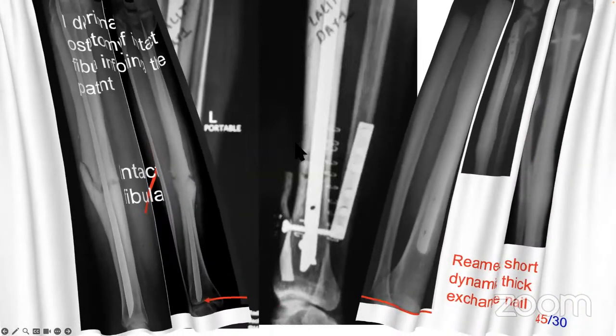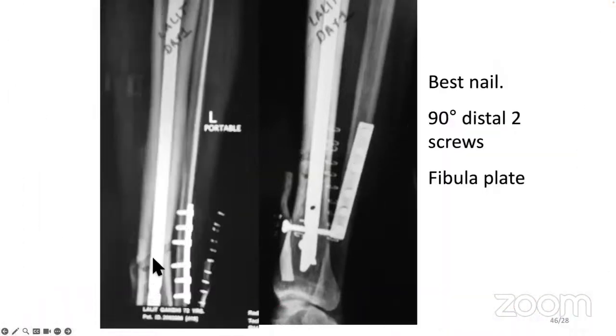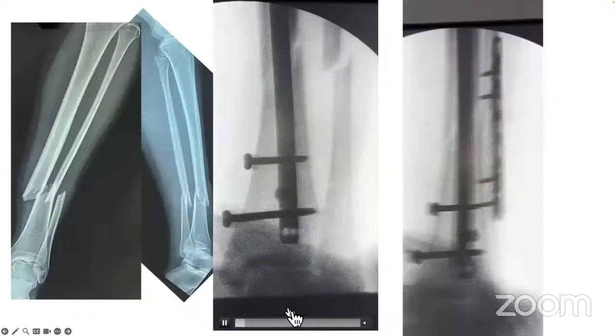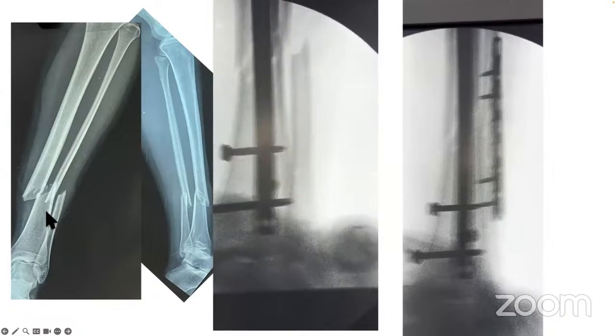Now, this lower one-third fracture, with the fibula plate and three screws still, it goes into non-union. You can see because it's an oblique fracture, it's not as stable as a transverse fracture. Transverse fractures are very stable, while oblique fractures may not be stable. This is the fracture which I treated.